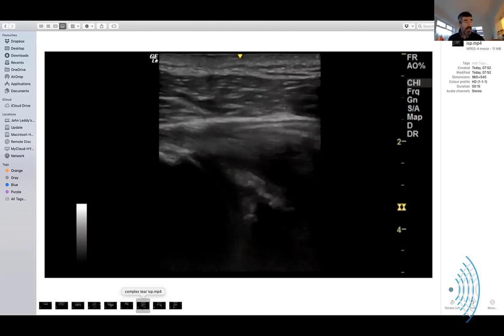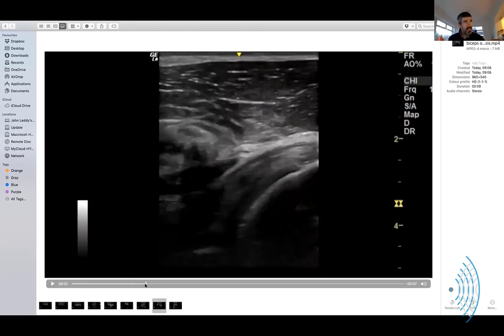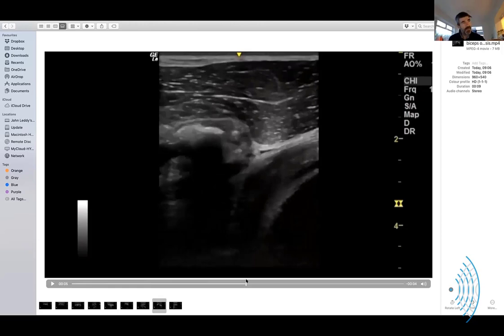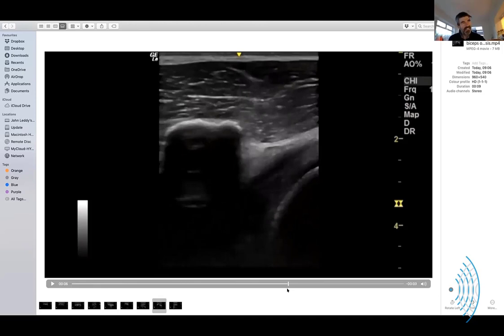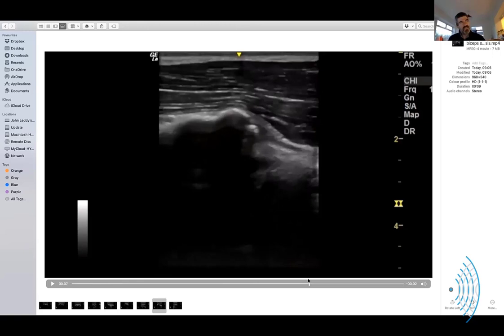And then just as an aside, this was his short head of, yes, biceps. Just a little bit of calcinosis there, as if he didn't have enough wrong with his shoulder. Calcinosis, as opposed to calcific tendonitis, or is it calcinosis if we're dealing with? I tend to try it. I'll just use calcinosis, maybe if I'm not ascribing any pathology to it.